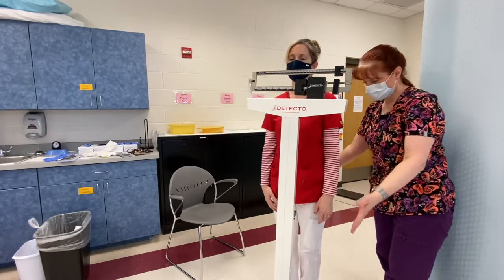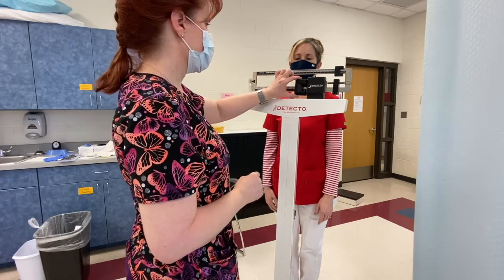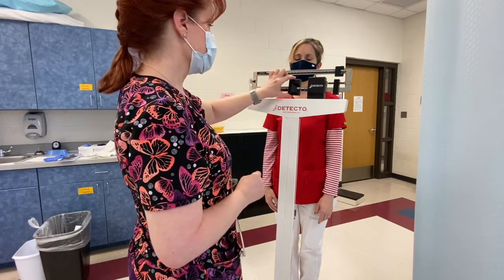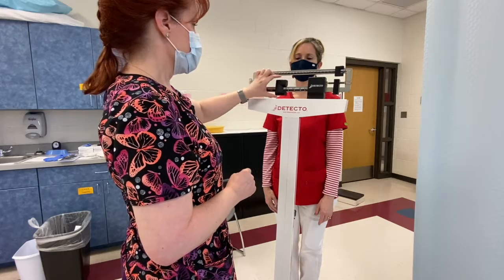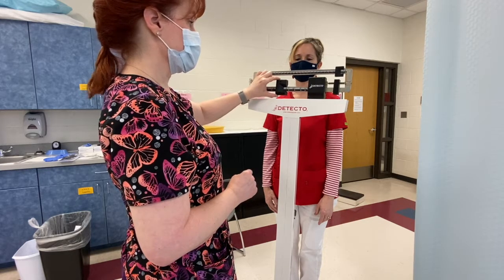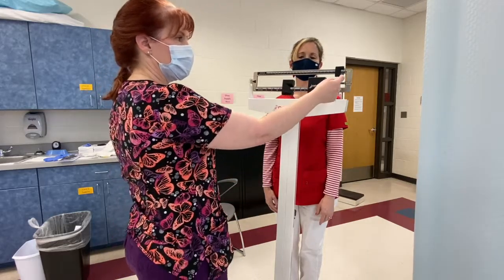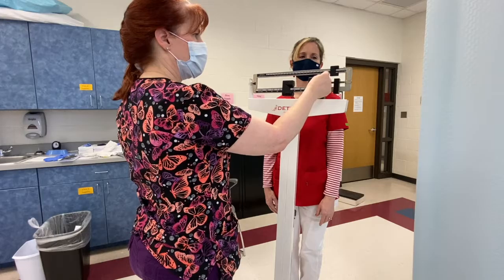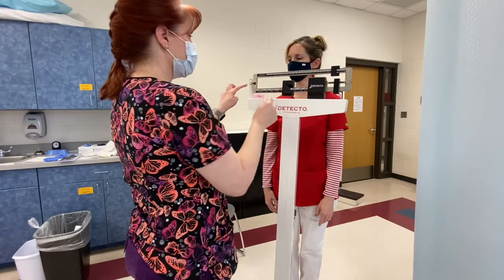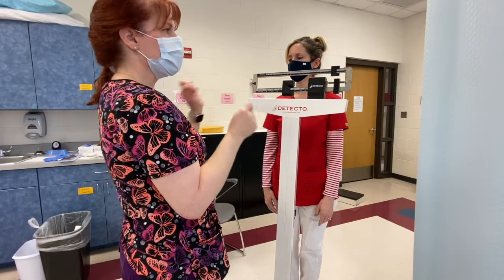Excellent. I'm now going to obtain her weight, moving the big scale at the bottom first. Now I know she doesn't weigh that much, so I go back to the next lowest 50-pound increment, and now I start moving my top scale.